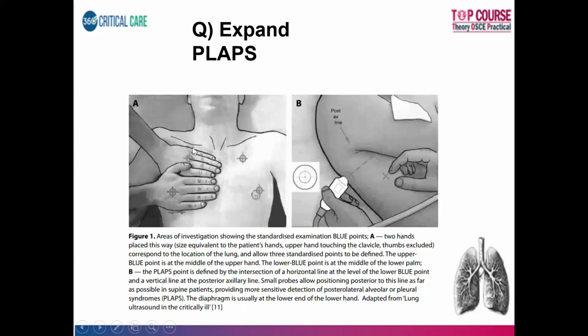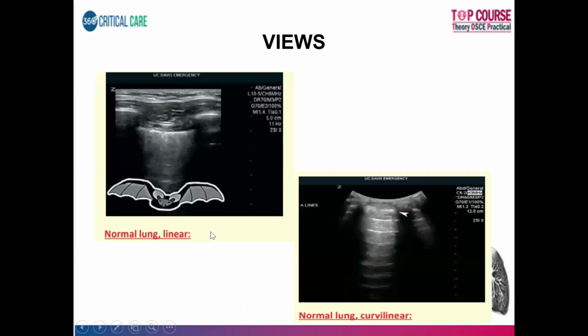little finger, the hand which is present here, would roughly correspond to the subcostal margin. So what you need to remember is that the upper hand margin will be just below the clavicle, and the lower hand margin will be at the subcostal area. This is roughly how you divide the anterior chest into upper and lower quadrants. Similarly, on the opposite side also you can divide them. If you feel that the nipple areolar complex is not accurate, or if the patient has undergone a mastectomy, so there is a problem with identification of landmarks, this is one rough method by which we can divide the quadrants. So this is about the surface landmarks.